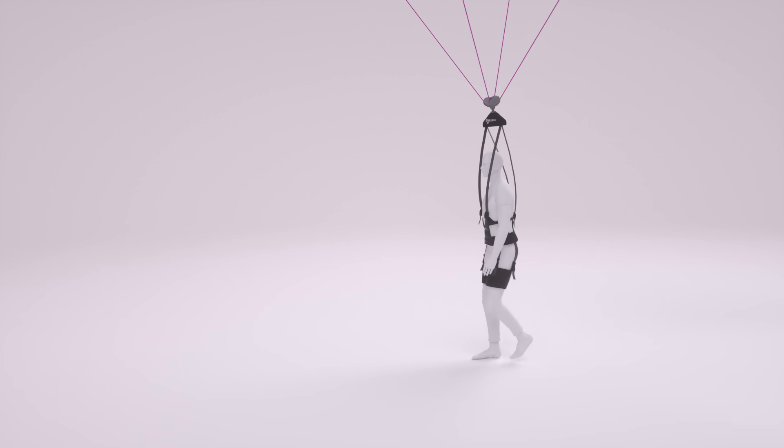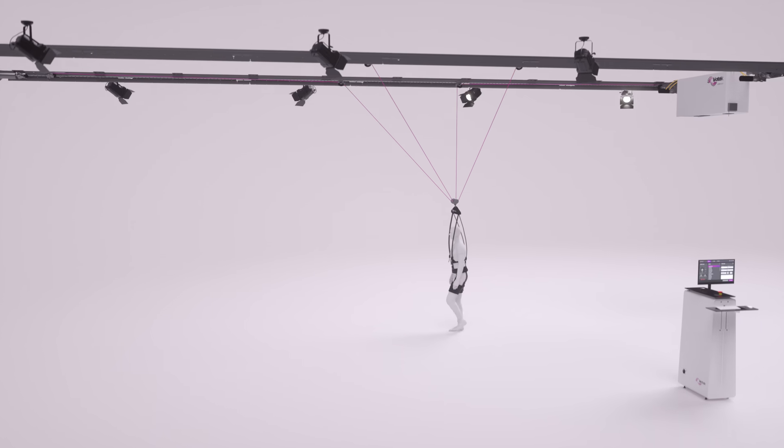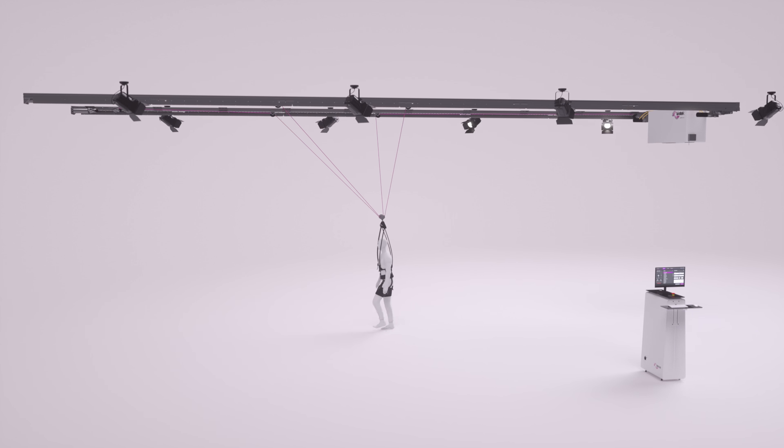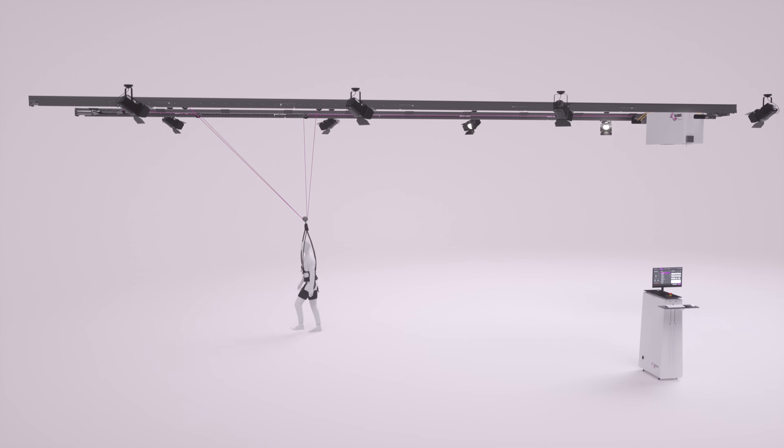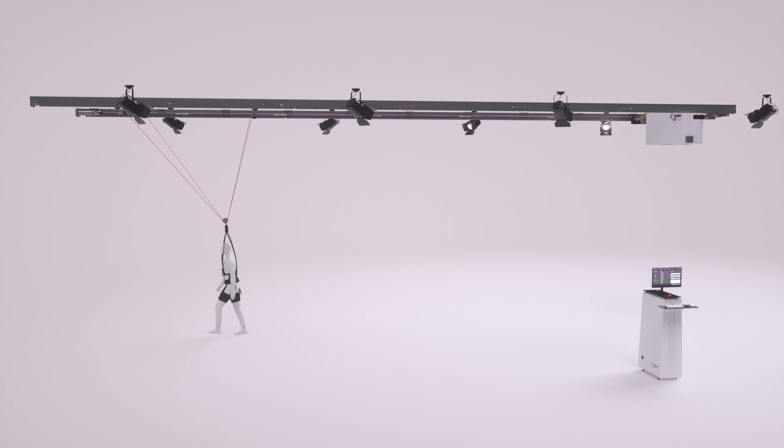The next generation 3D body weight support system offering patients the all-directional assistance they need to improve their locomotor activities without limitations.